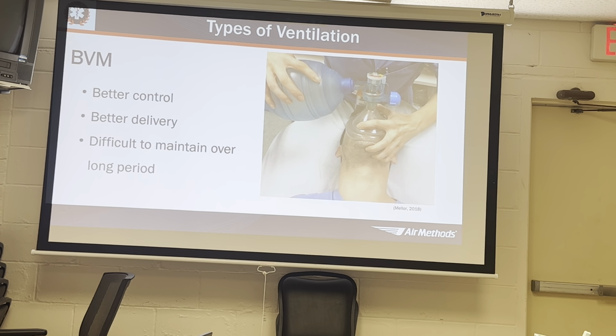This bag does have a manometer. Do your bags have manometers? Most bags don't. On most pediatric and infant bags, the best thing to do is maintain within that green window. But if your kid's not getting chest rise, go beyond it. When we're bagging somebody, we're looking to make sure that we get adequate chest rise, regardless of the peak inspiratory pressure that the manometer on the top is telling me. But making sure we're getting good chest rise and fall.